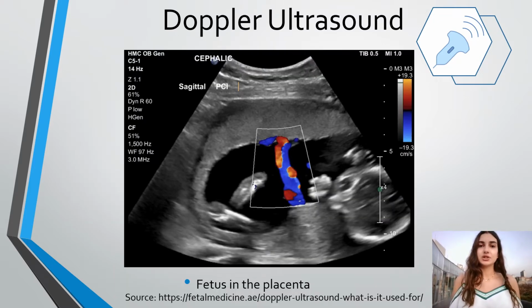A Doppler ultrasound is a type of imaging test that uses sound waves emitted by moving objects, such as blood cells, to measure their flow in vessels. So the echo from a moving blood cell comes back at a different frequency. This frequency difference is used to calculate the speed. Doppler ultrasound is mainly used for a fetus heartbeat or to examine blood flow in arteries.